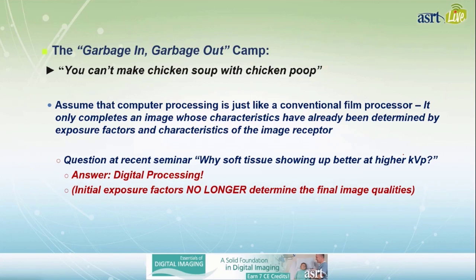But this is not what we're dealing with. Rather, what we're dealing with in an X-ray beam is good information that has had some bad information in the form of scatter added to it. In this case, if we can simply remove that noise, then we will have a good image remaining. The computer is perfectly capable of removing most forms of noise from the incoming signal, and that includes most scatter.